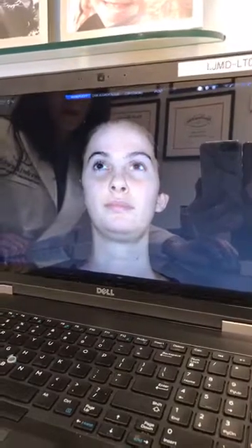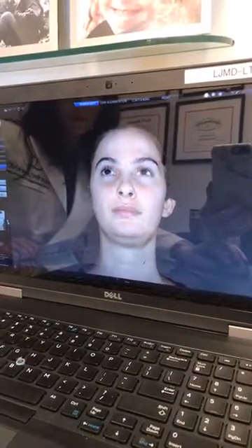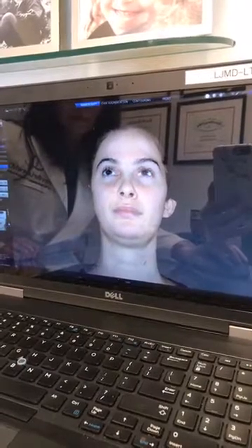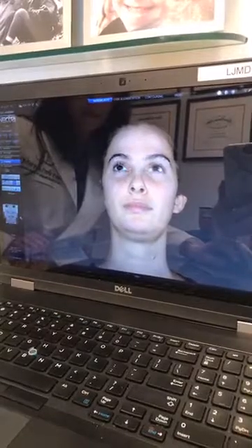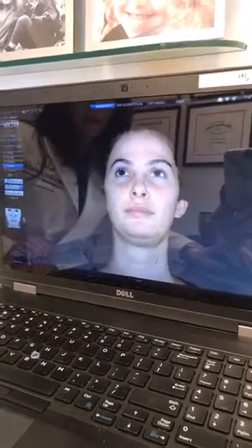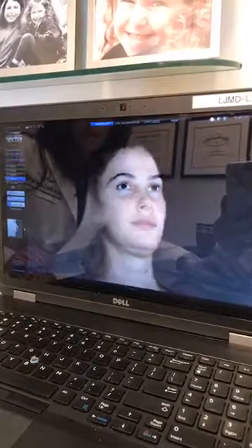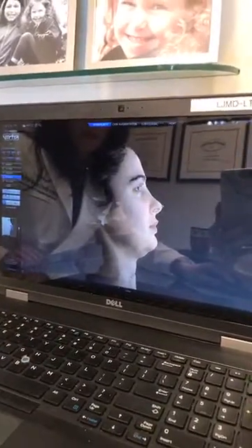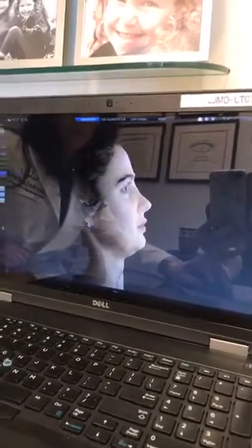And we could also narrow it progressively as we go down. We can take the base in. We can play around with the tip rotation. So these are just some things that we could do.